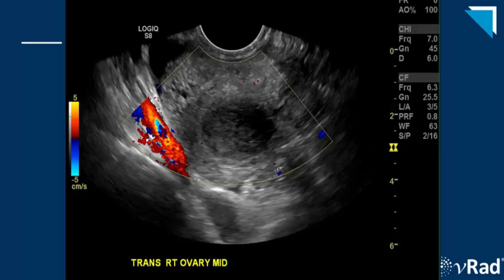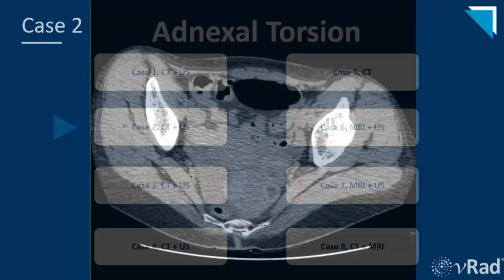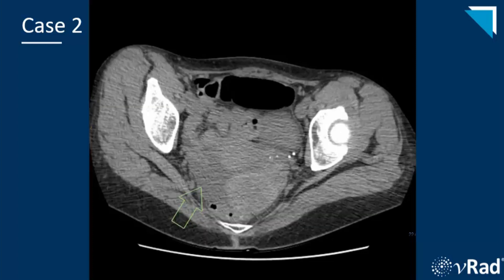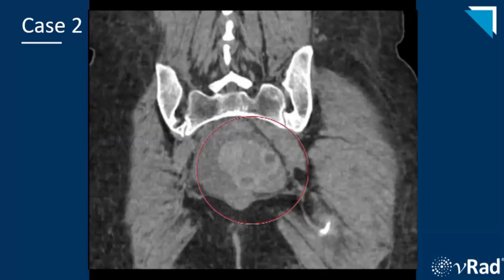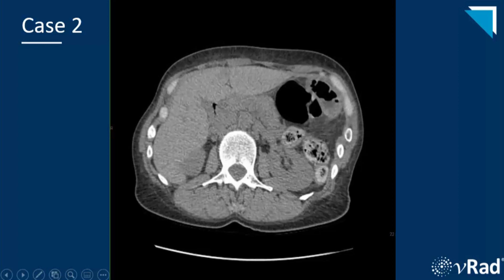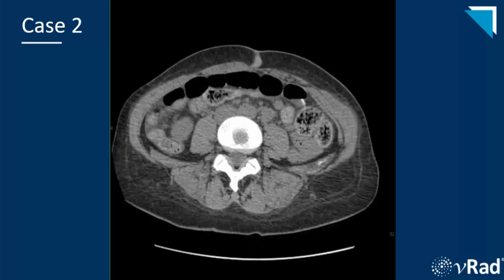Moving on to our next case of torsion shown initially on CT. The red circle surrounds the enlarged and hyperdense left ovary with surrounding free fluid — typically more than you would expect in a reproductive-age woman. Showing the same findings coronally — coronals can really be helpful to get an idea of ovarian size, and if you are really lucky, you might see an adnexal twist. Here is the full non-contrast CT showing the full extent of the pelvic free fluid.